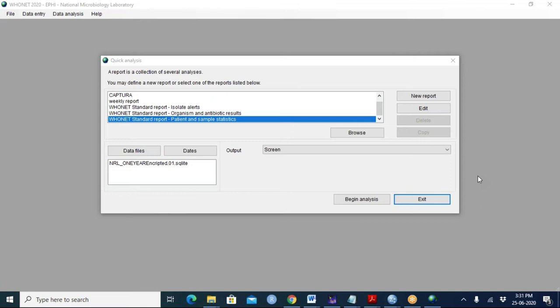I think it would be nice to do like 0 to 18, 19 to 64, 65 and up. People who work in pediatrics often want to do less than 1, then 1 to 4, 5 and so on. So there are different reasons why different people would want different age groups. It's definitely something we want to do.